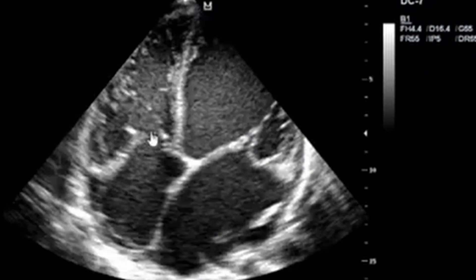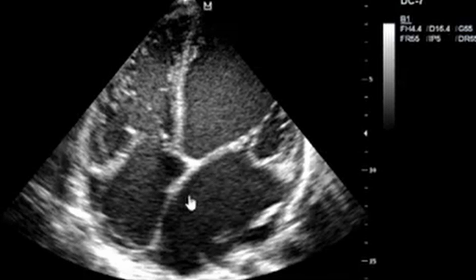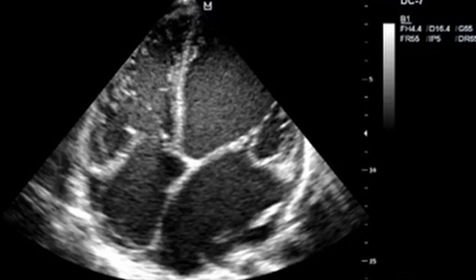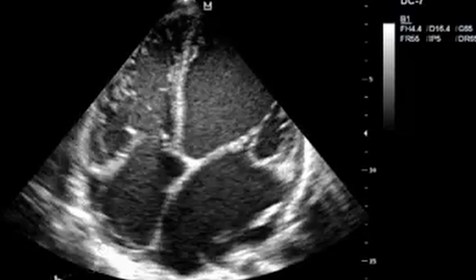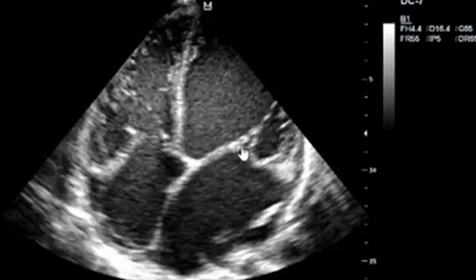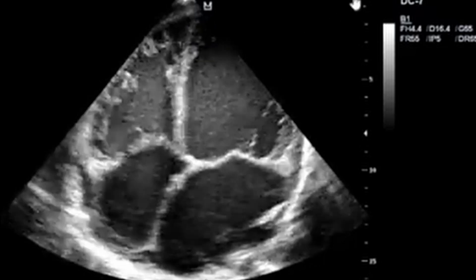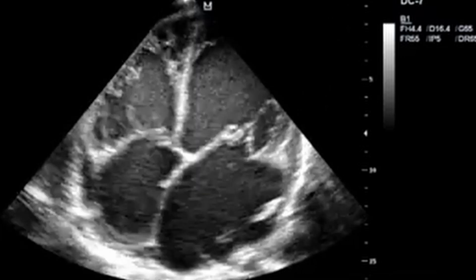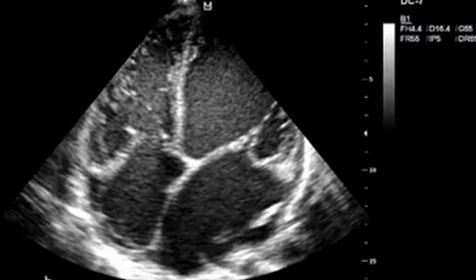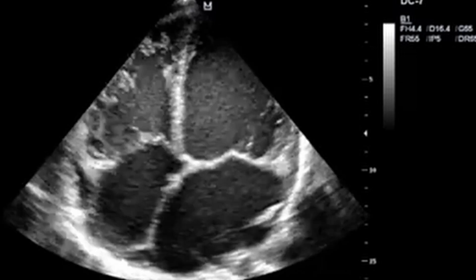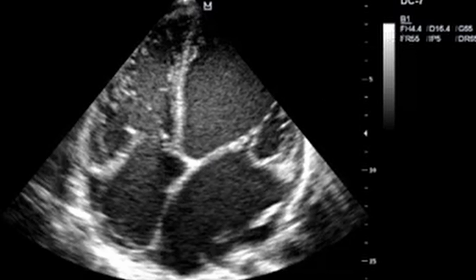Here is the four-chamber view. You can appreciate the tricuspid valve and the mitral valve, the interventricular septum, left ventricle, left atrium, right atrium, and right ventricle. This patient is presenting with valvular heart disease, showing doming on the tricuspid and mitral valves, with loss of systolic function — a case complicated by calcification of the valves.